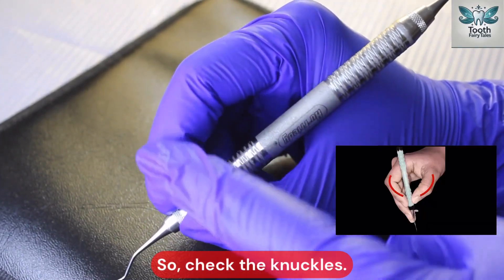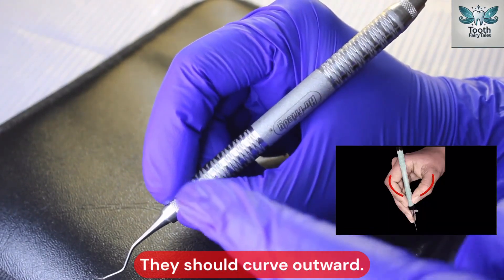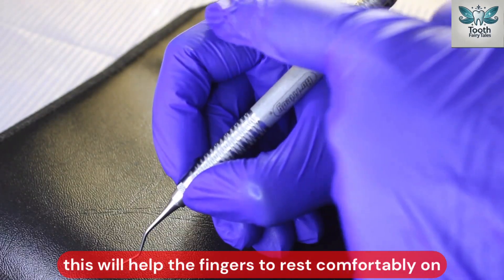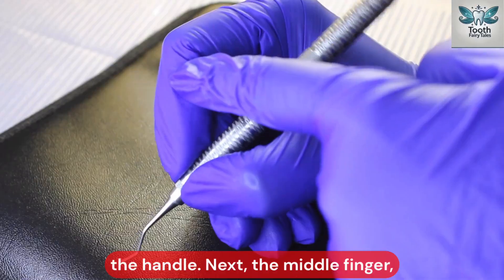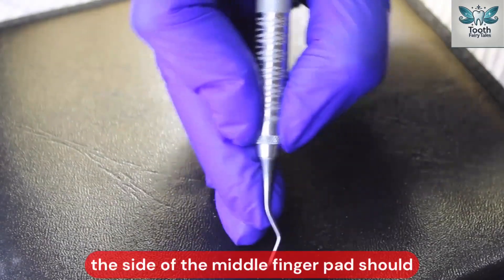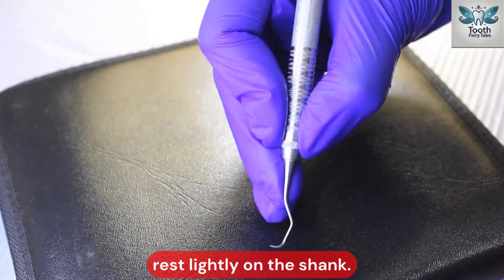Check the knuckles — they should curve outward and should not collapse inward. This will help the fingers to rest comfortably on the handle. Next, the middle finger: the side of the middle finger pad should rest lightly on the shank.